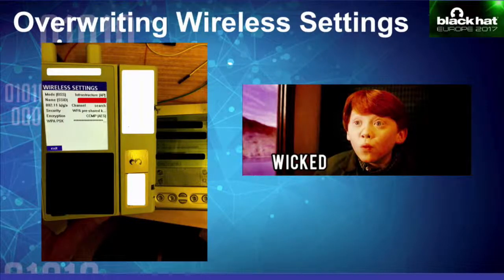So we were a bit disheartened, but we did what you do to a template. We filled it. We took all the settings from our rogue wireless access point and filled the template with all those settings. So we put in the wireless access point name, our own username and password, security settings, WPA, WPA2, etc. Once we completed the whole template, and it was a pain to type it in there, we attempted to beam it back to the infusion pump over IRDA.